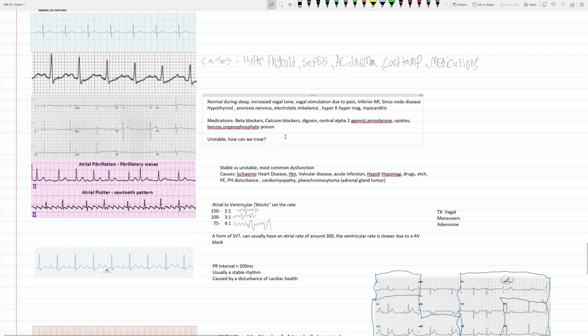Typically, you start from least invasive to most invasive. So we're going to start at the standard rate of 60 beats per minute. If the patient has a decrease in symptoms and an increase in perfusion, we'll leave it at 60. If the patient is not perfusing and is still symptomatic, we'll crank that rate up until we titrate it to an effective rate that meets the patient's demands.